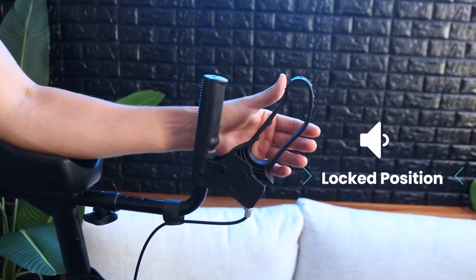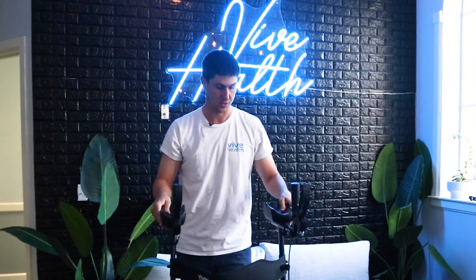First things first, really whenever the item is in use, especially when you're trying to stand and sit, make sure your brakes are locked. You push them out fully, hear the clicking sound, and that will stop it.